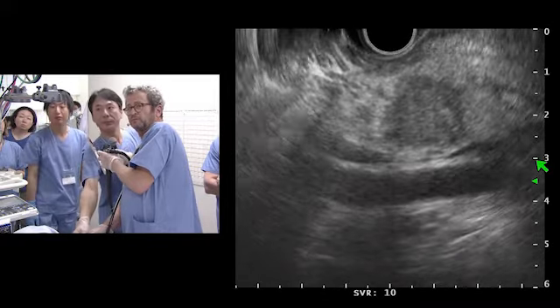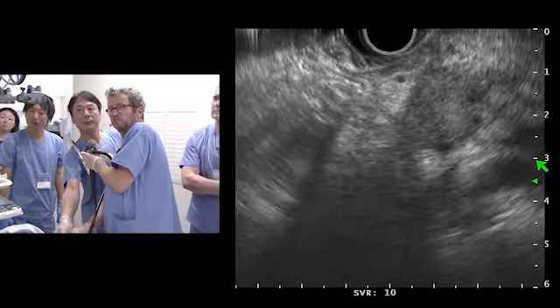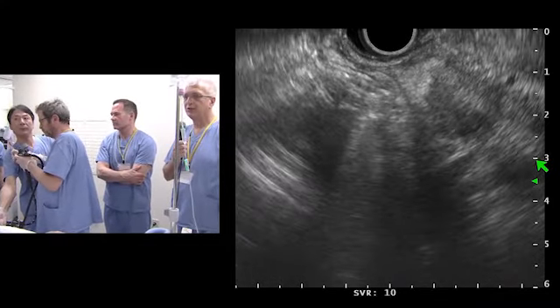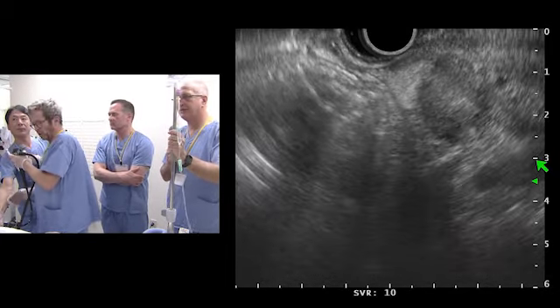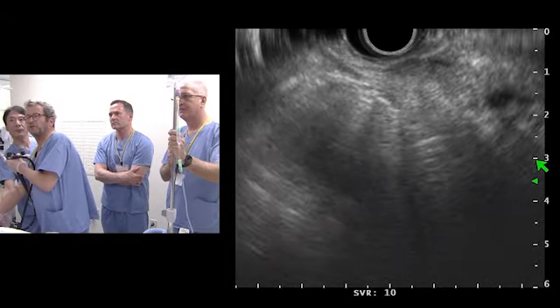Okay. So the purpose here is to have the lesion in a good position for the axis of the needle, and to avoid passing through too much of the normal parenchyma of the pancreas also. Yes, but we are obliged to pass a little through normal parenchyma.